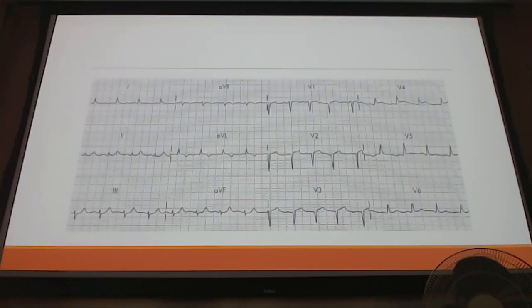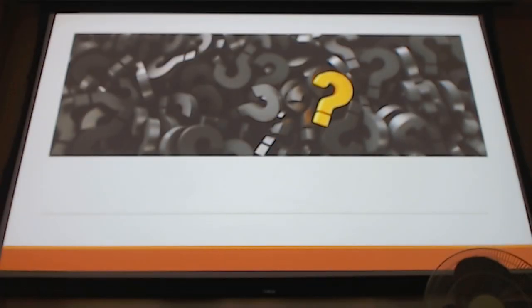Anterior. This one's a little bit more subtle, but yeah, just a similar bump. Similar to the last one, that's an anterior. And roughly 30% of STEMIs don't have reciprocal changes. All right, that's all we're covering on that one.